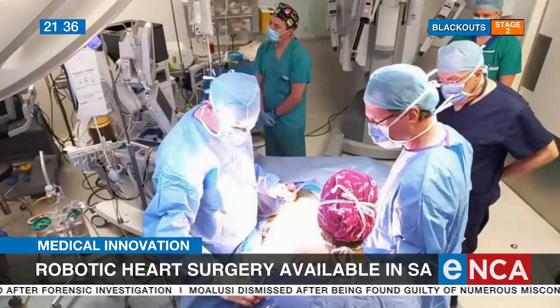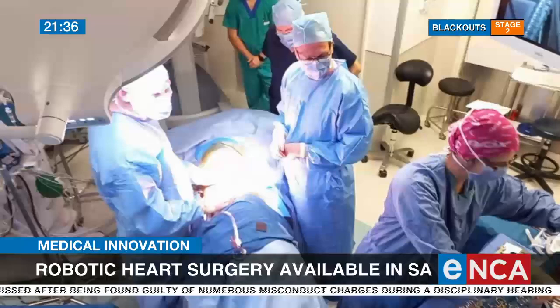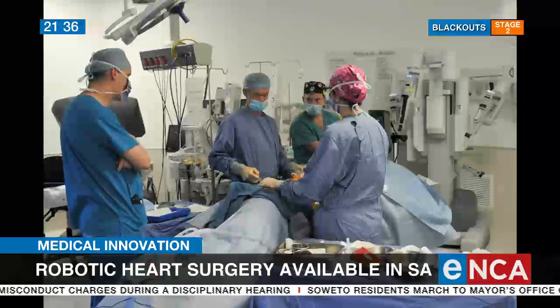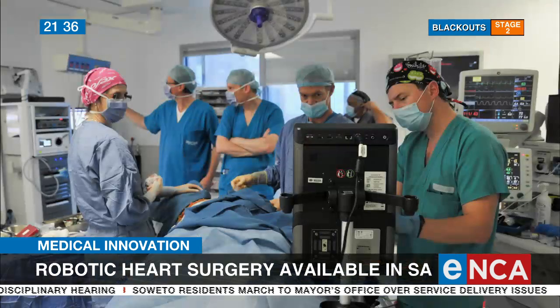Yeah, so what we set out to do is to establish a safe and sustainable program in the long term. We have to be very careful as to what sort of cases we start off with. And we decided to start off with low-risk patients and low-risk surgeries and operations. The first case we did was a patient with what we call thoracic outlet syndrome. That is where the nerves and the vasculature of the upper limb are compressed between the collarbone and the first rib. This patient had extreme discomfort, especially from a professional perspective as well.